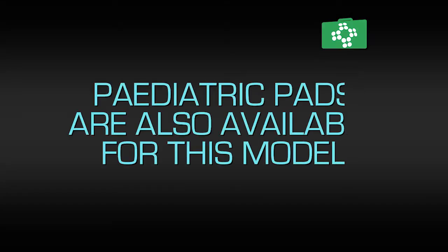The 360p is suitable for adults or children. For children younger than 8 years or weighing less than 25 kilos, a paediatric pad is available.